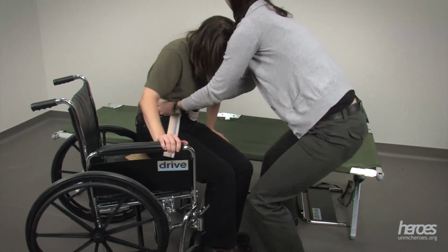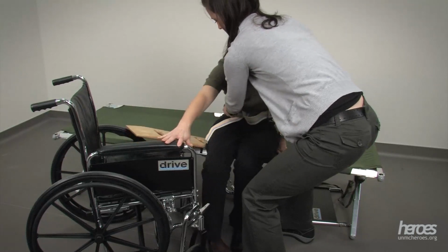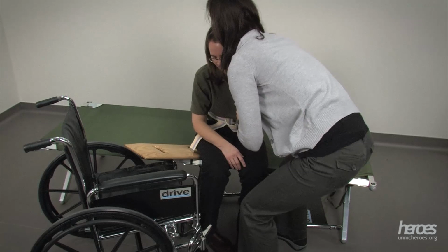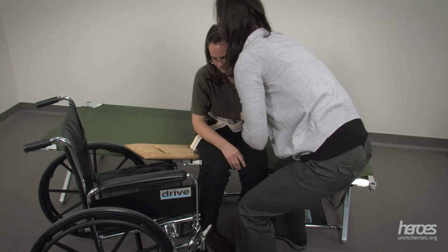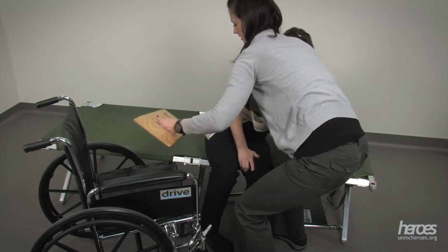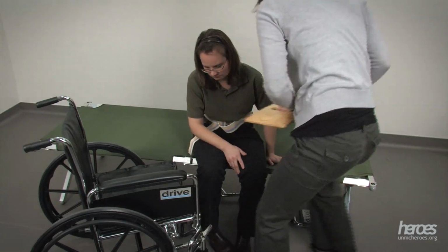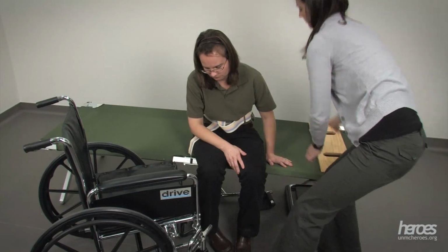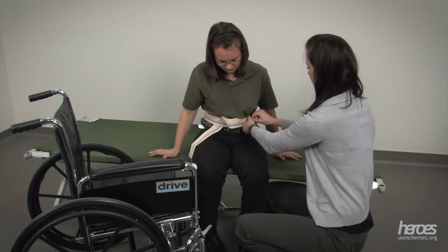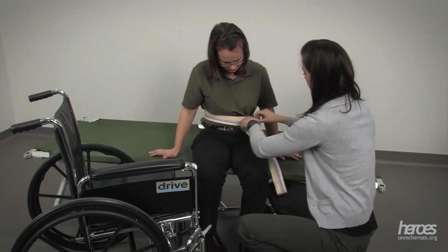And if the individual is able, ask them to push through their feet as well to help move across the slide board. Once the individual is all the way onto the cot, have them lean slightly away from the wheelchair so that you can more easily remove the slide board. Make sure to have one hand on the gait belt as you remove the slide board. Once the individual is safely transferred, you can remove the gait belt from the individual's waist.